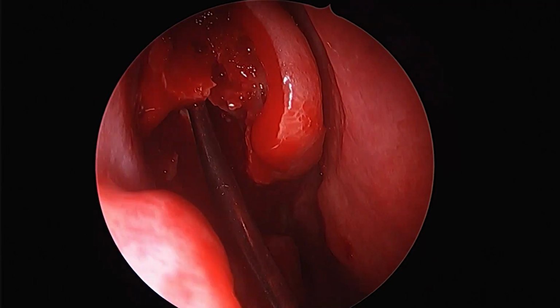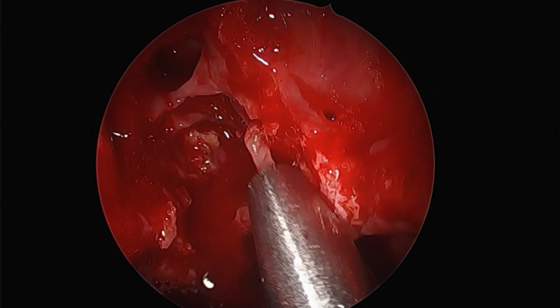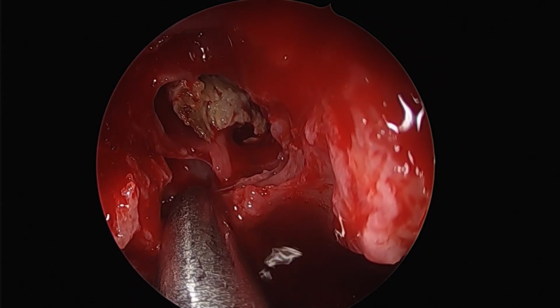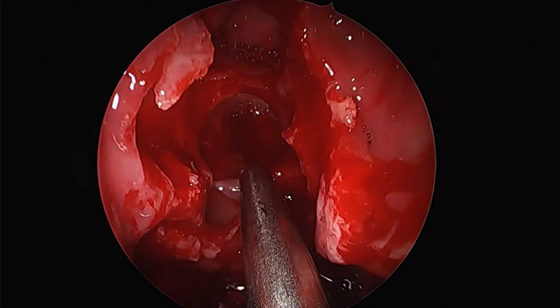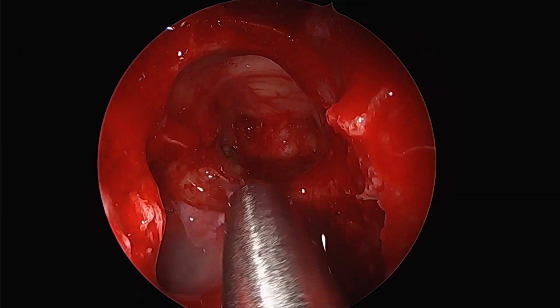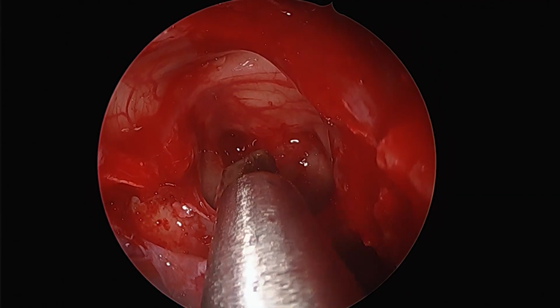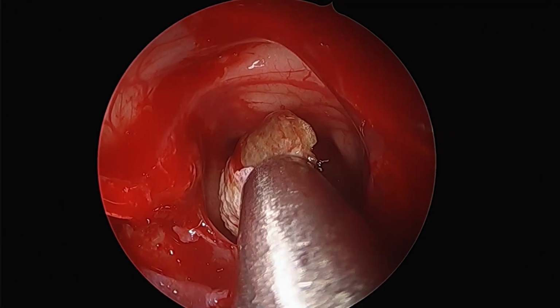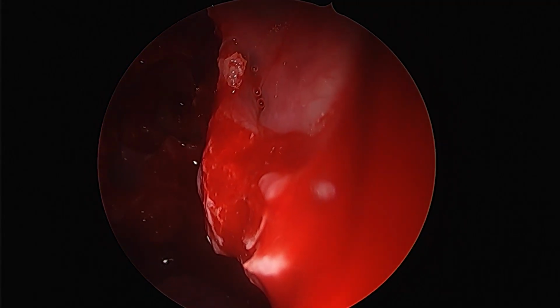Now, as we get the entire face of the basal lamella off, what we see indeed is quite a revelation, and that seems to be a fungal ball that is lying inside the posterior ethmoid. Now, this could be an isolated fungal ball for which the posterior ethmoid is, we could say, an uncommon location. You can see this fungal ball being taken out of the posterior ethmoidal system.